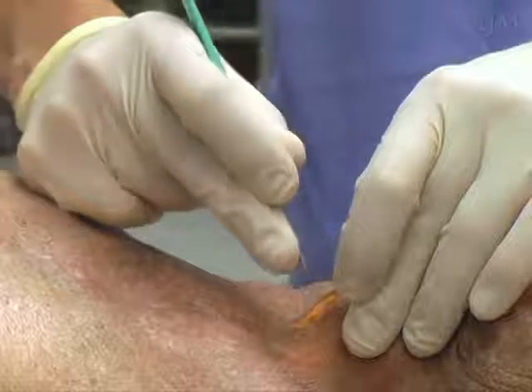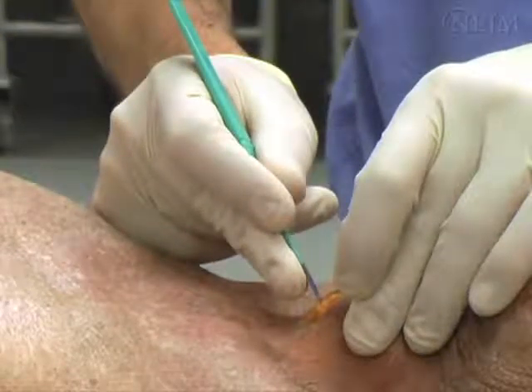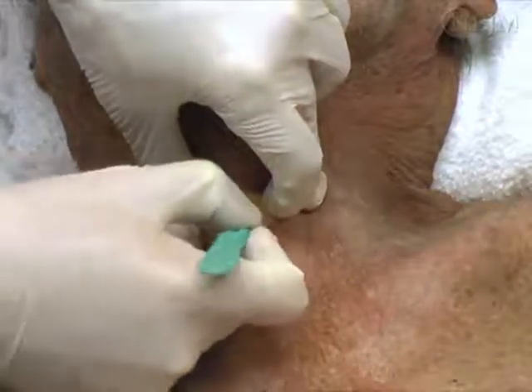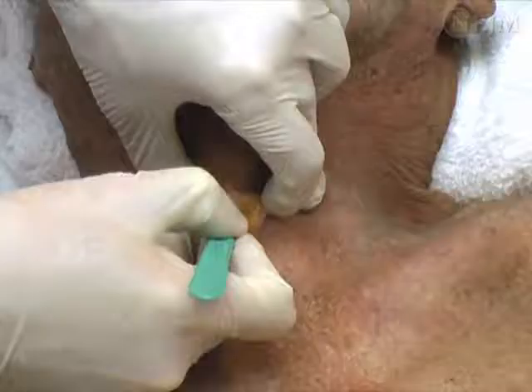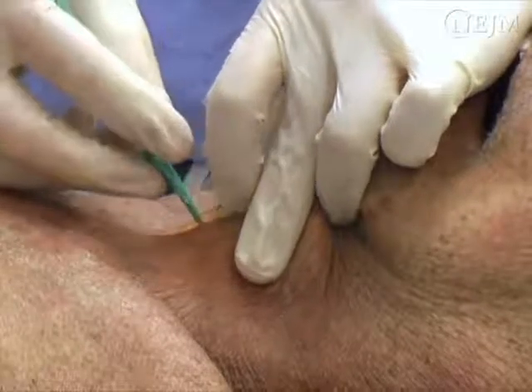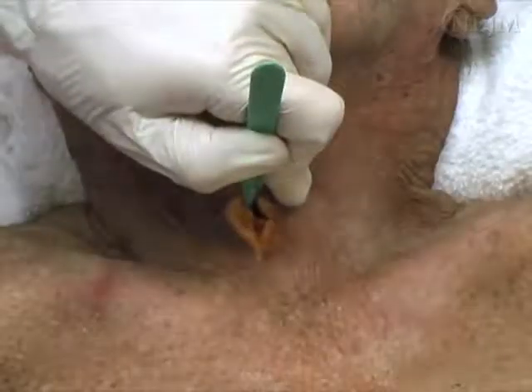To minimize the risk of esophageal perforation, hold the scalpel between your thumb and index finger and allow your middle finger to extend down the side of the scalpel, leaving the distal 1.3 centimeters of the blade exposed. If the patient is trying to breathe, once you enter the trachea, airflow should be audible and may also be visible. Once the trachea has been entered, make sure the blade stays within the incision so that communication with the trachea is never lost.